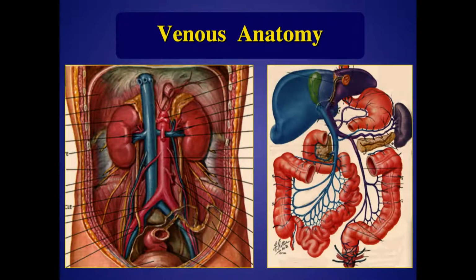As we get more and more dependent upon our sonographers to show us these findings, I think it's really important to spend the time with them to review the anatomy and some of the tips and tricks to find these vessels and to let them know what we're looking for. One of the ways I do that is by sharing some of the CT and MR images on these patients to show them where the pathologies might be and where they should be looking.